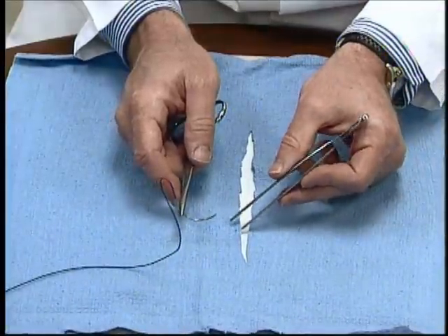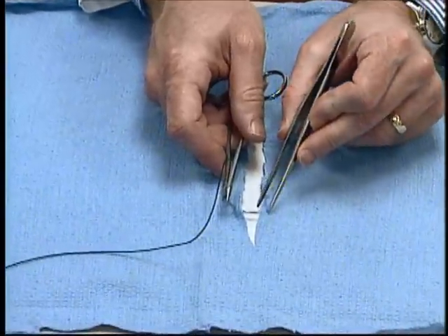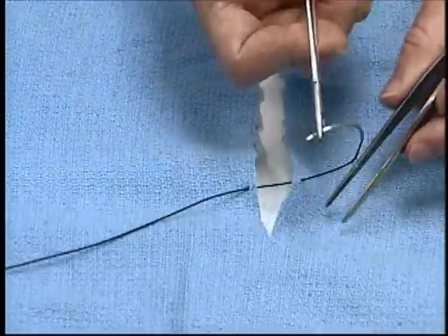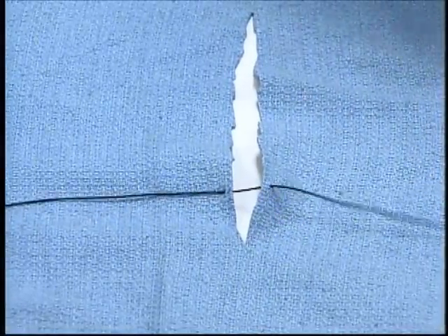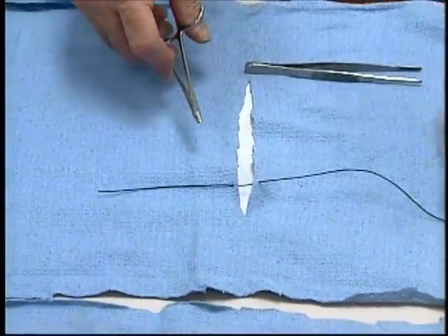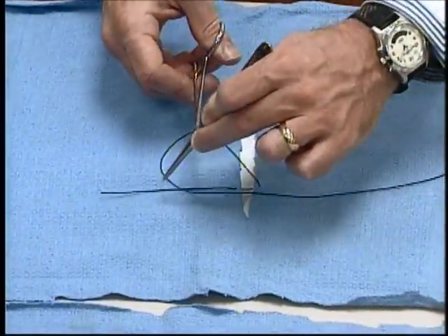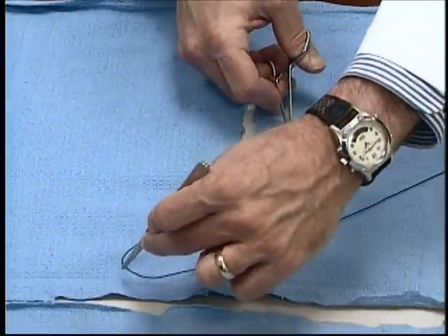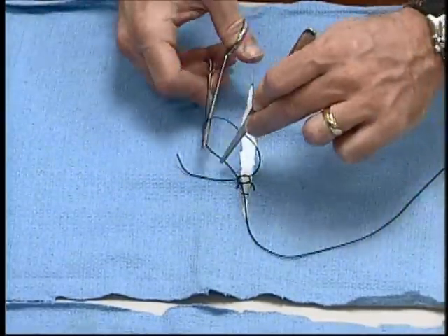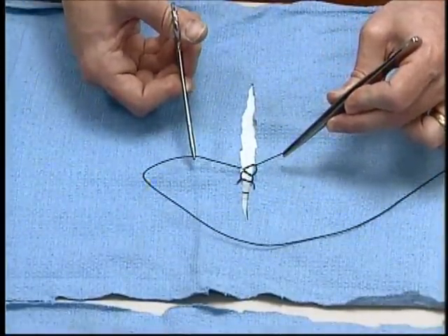The needle is passed through the tissue by everting the skin edge 90 degrees — here we use a towel to demonstrate — everting the opposite skin edge, passing the needle by rotating the hand, and then tying the knot. People usually either pick up the suture by hand and make a loop, or more elegantly use the forceps to pick up the suture and, crossing the hands, make a flat square throw followed by another flat square throw, and maybe even a fourth. Notice I have not tightened these down just to demonstrate that they are all square knots.